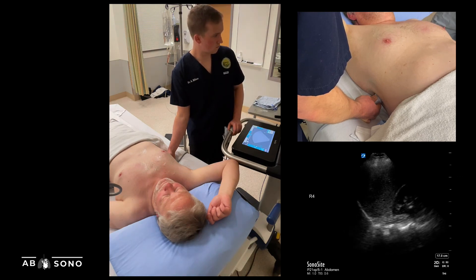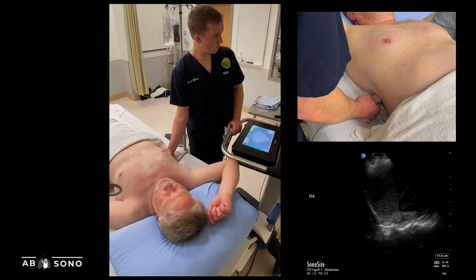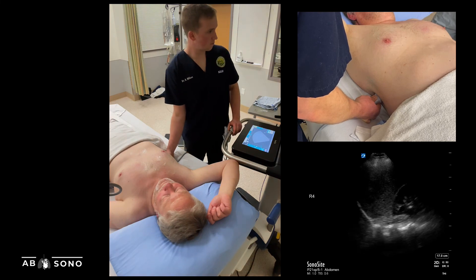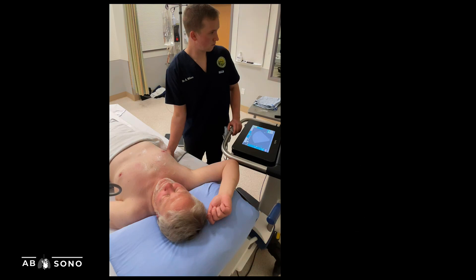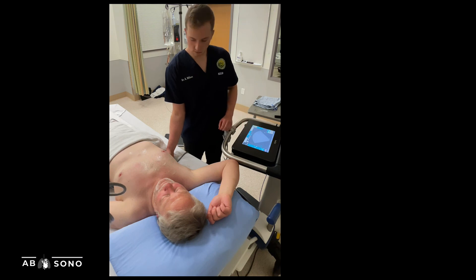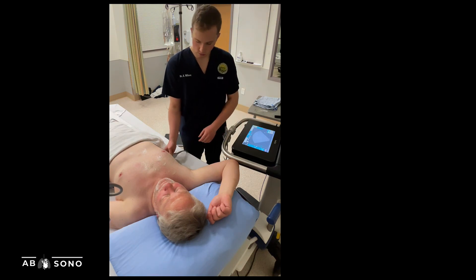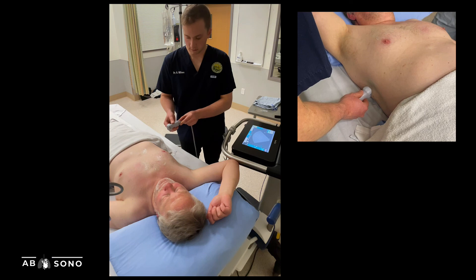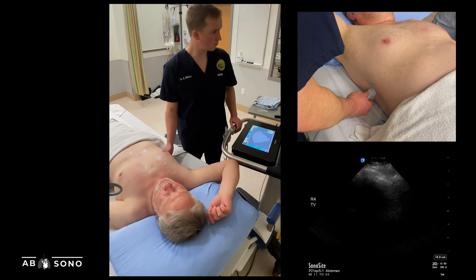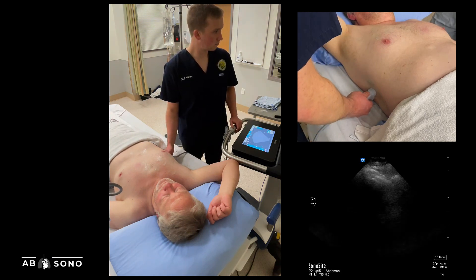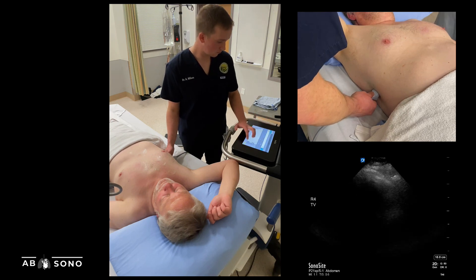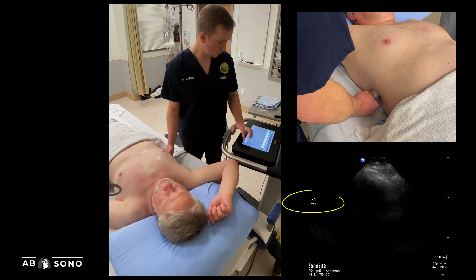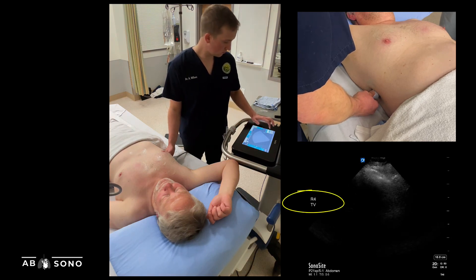If pleural effusion or consolidation is present, obtaining additional clips of zones three and four in transverse orientation can provide additional information and assist with estimating effusion size. Rotate the probe so the marker dot points anteriorly. Ensure the image is labeled with the zone and TV for transverse — for example, on the right side this would be R4TV.